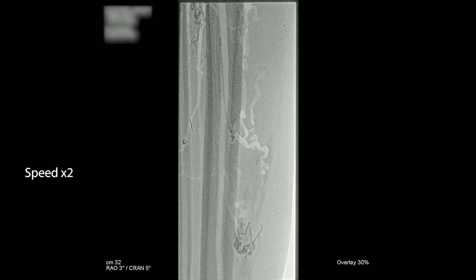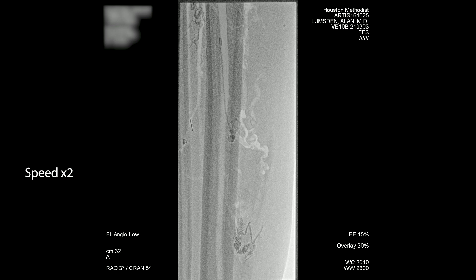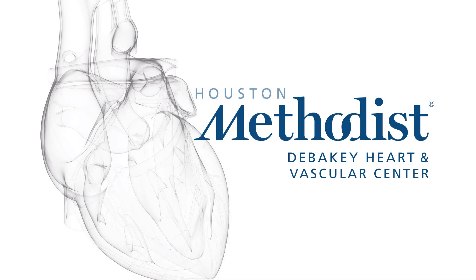Let's shoot a digital subtraction angiogram and see how it's looking. We've managed to take out those vessels feeding into the area of the skin. What I did beforehand was ask where it was hurting and try to make sure that's the area we specifically targeted. Thank you again for watching this example of a multi-component arteriovenous malformation — she did very well post-procedure.